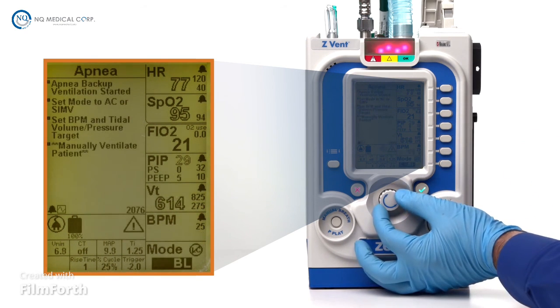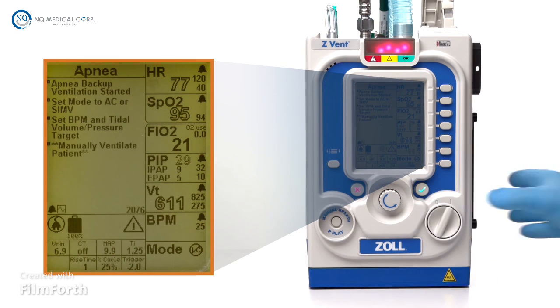In bi-level, or BL mode, the ventilator assists patients breathing spontaneously through 2 pressure settings: a higher inspired positive airway pressure, or IPAP, and lower expiratory positive airway pressure, or EPAP.